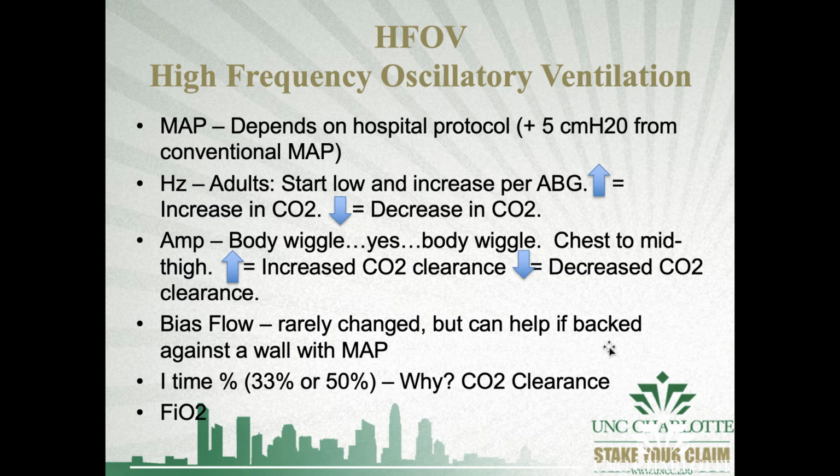Now our hertz are kind of counterintuitive, so I keep referring to our hertz or frequency as our breaths per minute. It's counterintuitive, and you probably already know this, but it's good for future knowledge. If you have an increase in your CO2, you're going to decrease your hertz. Okay, you're going to decrease your respiratory rate.